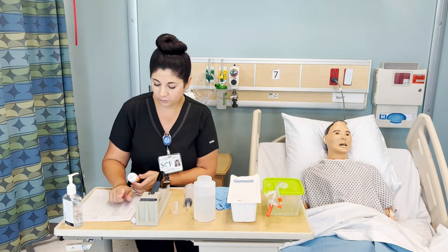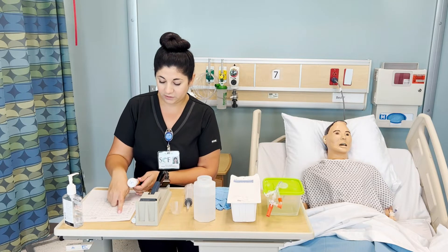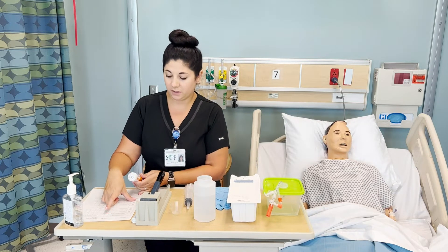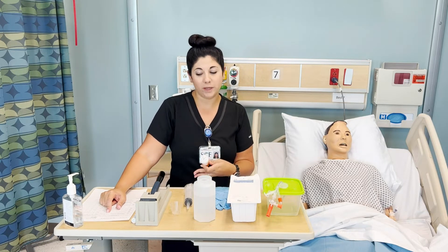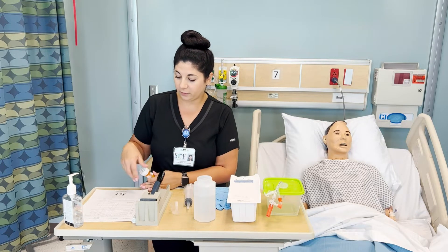I'm going to read the medication name on my MAR and on my medication, read the dose on the MAR and on the medication, and check the route. It should say PEG on there. This tells us that pharmacy is aware that it's going through a PEG tube and it's not a PO medication. We're checking that it is the correct time and we have the right frequency.